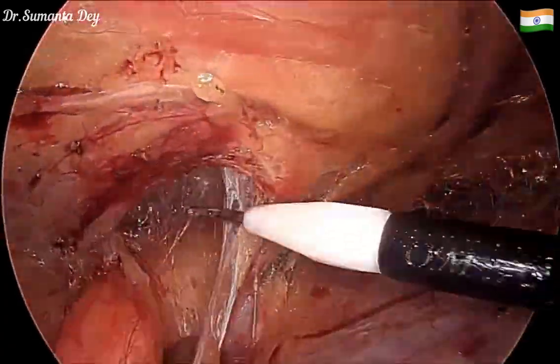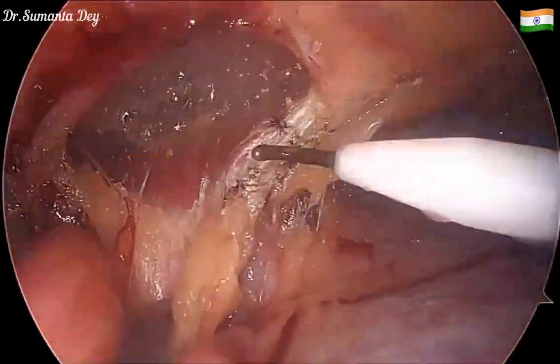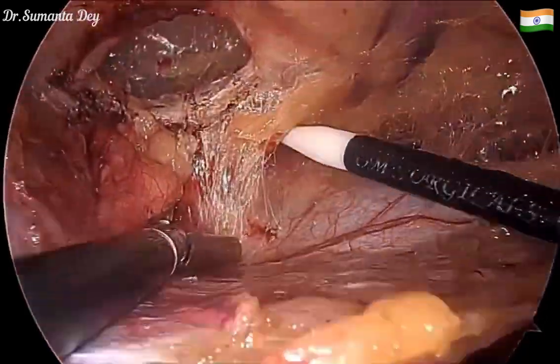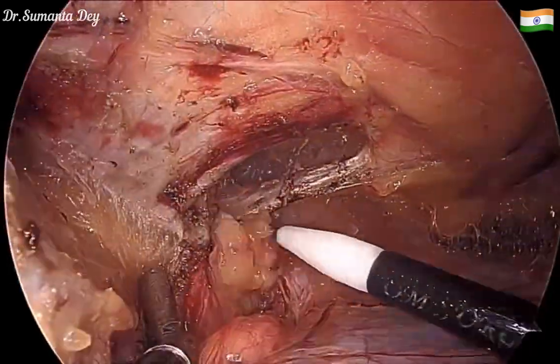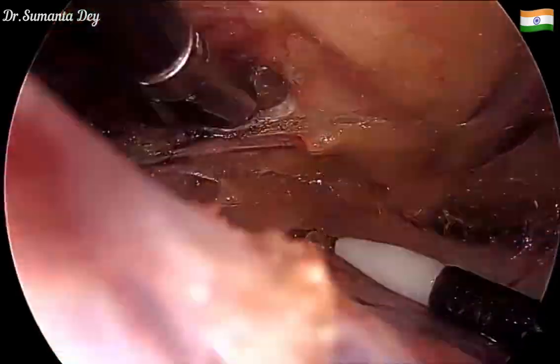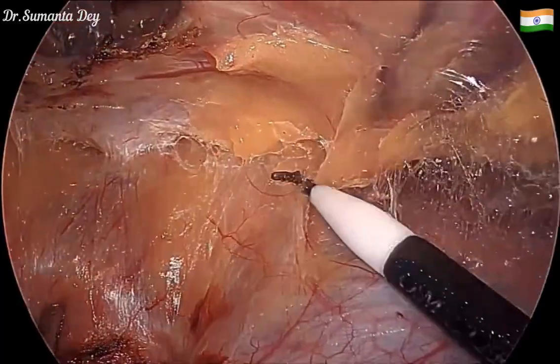The defect margin is now getting visualized. Once the hernia sac is reduced, the preperitoneal fat and the hernia sac are now completely reduced without any rent in the hernia sac, and we are now beyond the hernia defect margin.